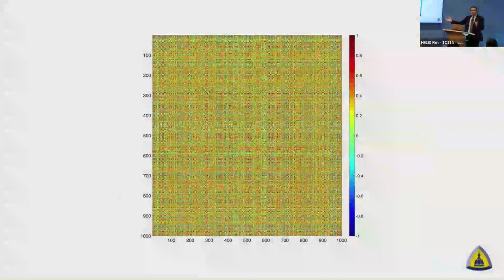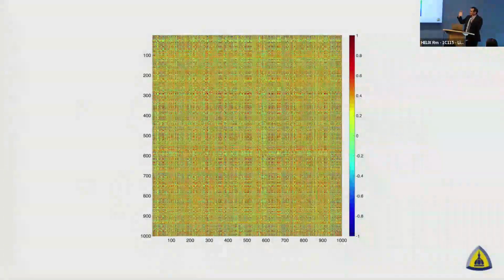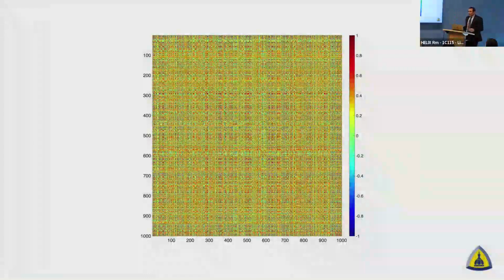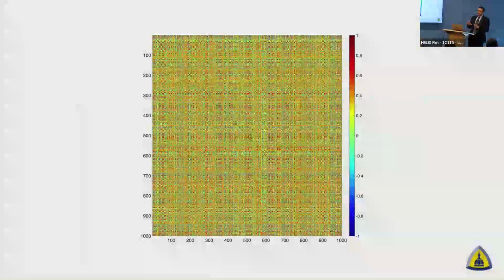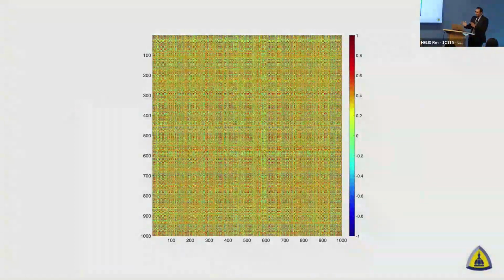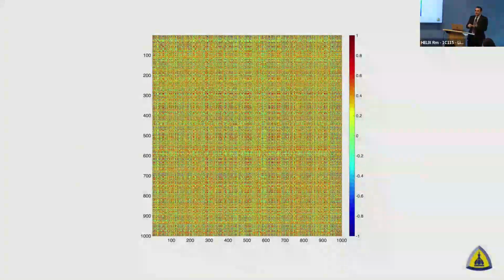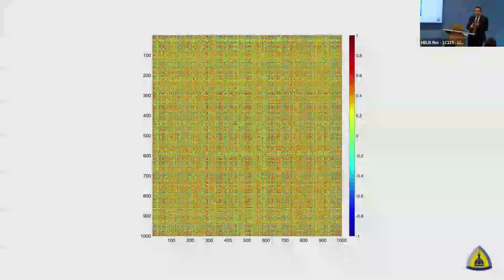Now, can anybody make sense of this or not really? No, right? Because it just looks like noise. All we did was calculate the correlations. But what if we shift things around so that ROIs, regions of interest, that had similar waveforms all move towards the same location? Let's say red and blue and yellow had similar waveforms.